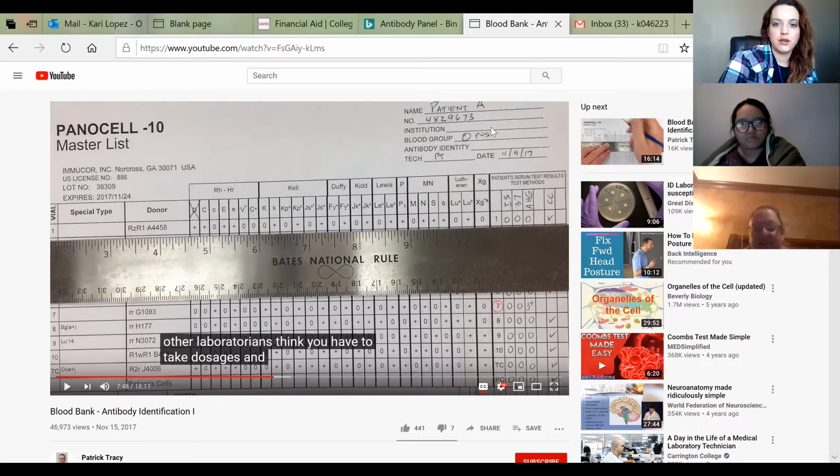I didn't understand any of that. None of it? Okay, we'll go over it too, but I think there's a great video to see it as we're talking about it. And I tried saving some pictures too that I'm going to try to incorporate. Oh, go ahead. Can you give us the name of the video? Because the captions are way too fast. Yes. Let me, and then I can go back later and pull that up. Yeah, so it is called Blood Bank Antibody Identification 1. And it is by Pat Tracy.